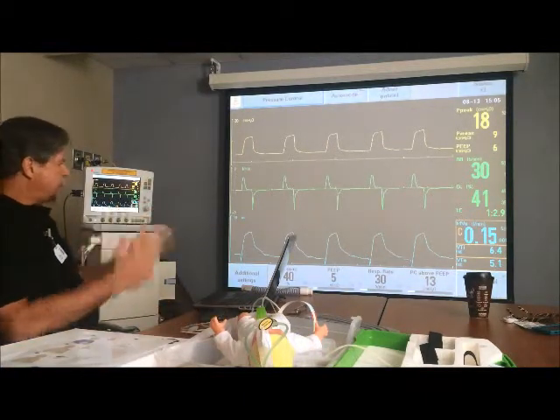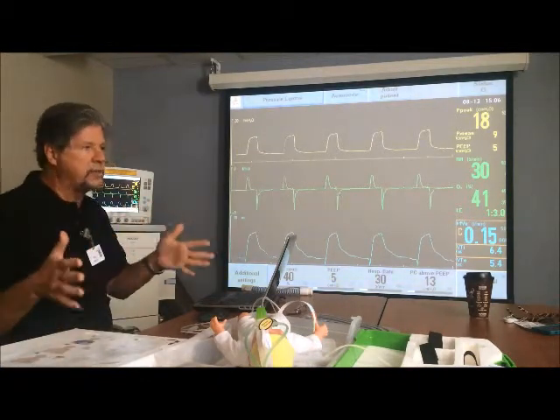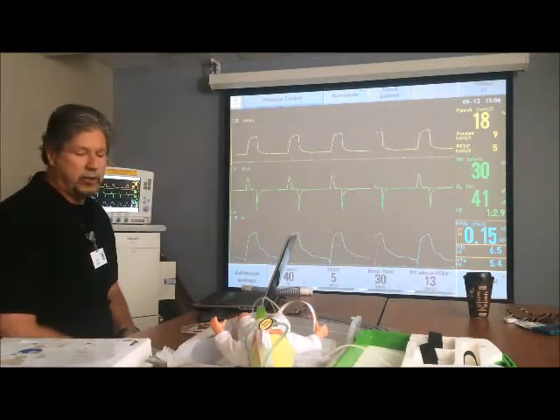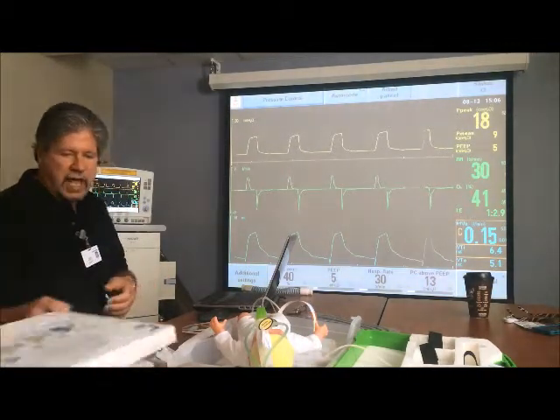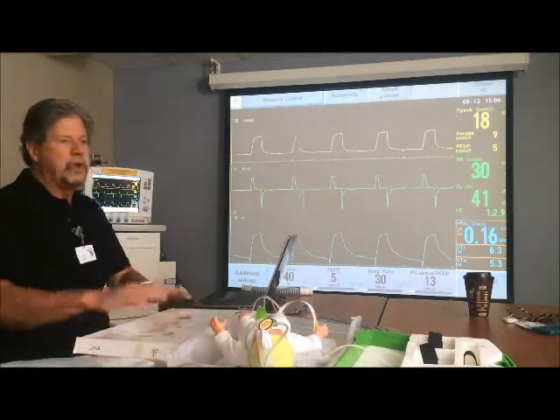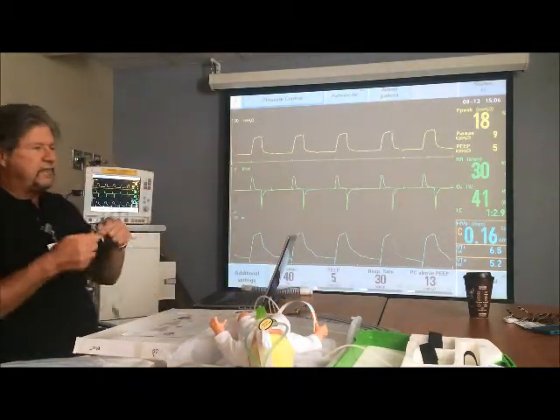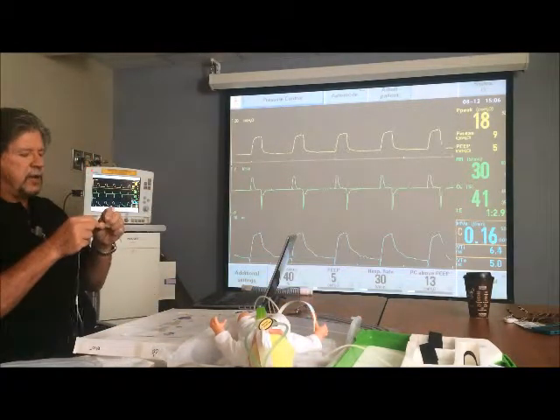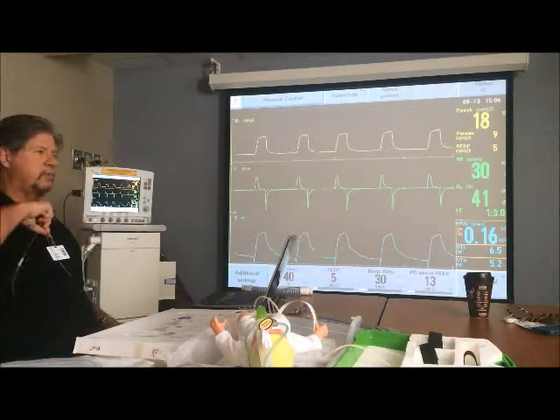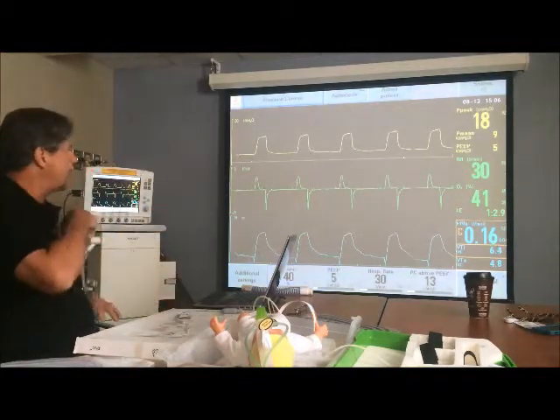So we say, for whatever reason, let's put the catheter in. So we get the catheter, we do all the measurements that we told you about, and we're going to use a 6 French 50-centimeter long catheter. We get the tray, we've done the measurement, we did the calculation. We know that the mark that we're going to put the catheter to will be, let's say, the 15 centimeter mark or the 18 centimeter mark, and we find that mark and say, okay, there it is, the 18 centimeter mark, and we're going to put it down. And so we put the catheter in.